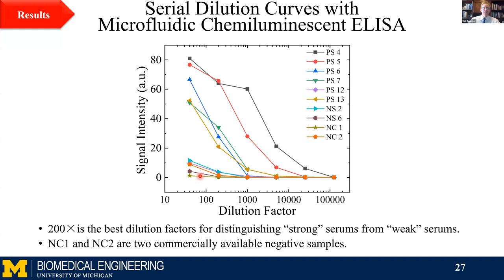And since it requires a very small sample volume, would this work for saliva or other biological samples? Definitely, we gave a try with saliva for measuring other markers other than the viral-related markers. That's great. We can even measure the markers from the mouse urine and mouse tail vein blood, because they all have very limited volume.